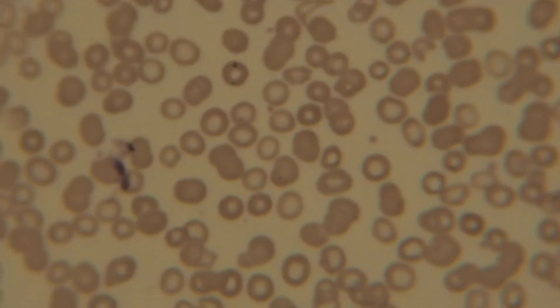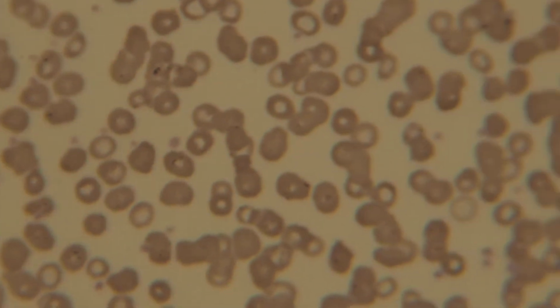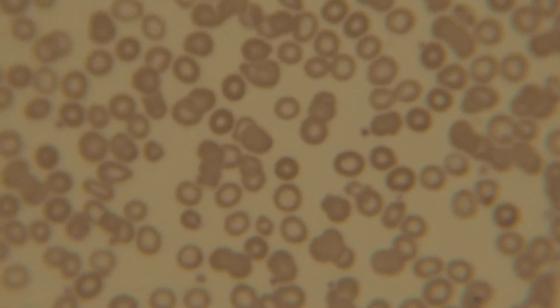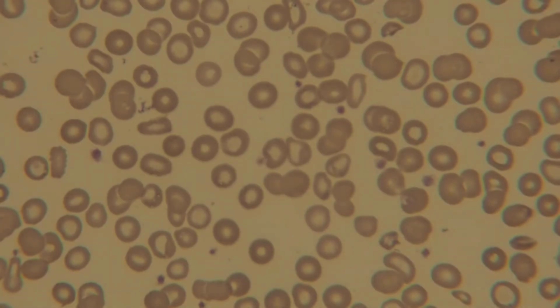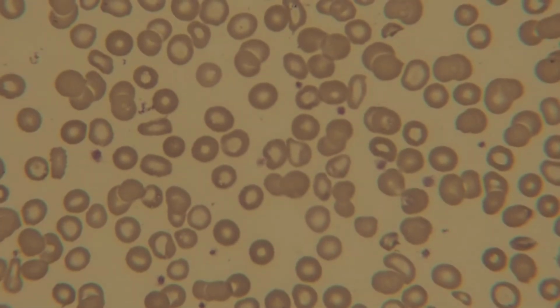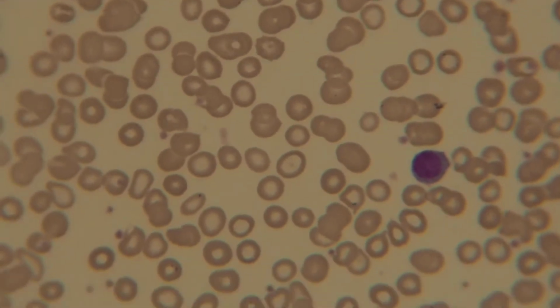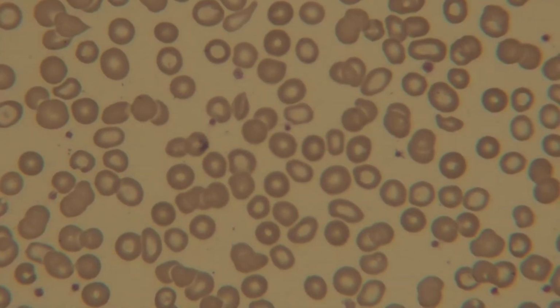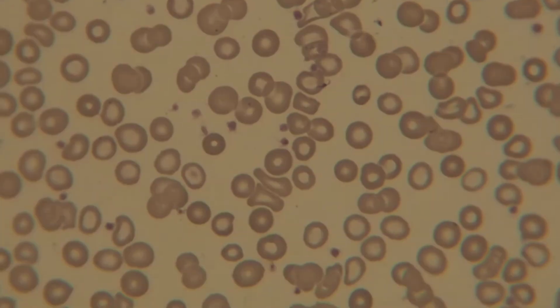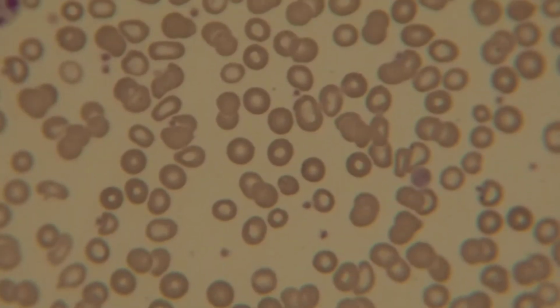Neutrophil. Lymphocyte. Definitely a level of rouleau. Look at the rouleau. I'm trying to go where it's less dense, because if you go where it's dense, every slide you see will have rouleau. If you go where it's dense, everything you see will have rouleau, okay? That's why you try to go in less dense areas of this slide, more towards the feather. Otherwise, it's always rouleau.